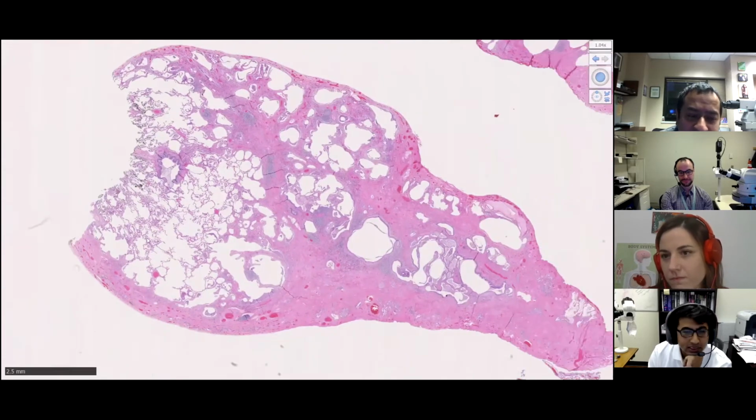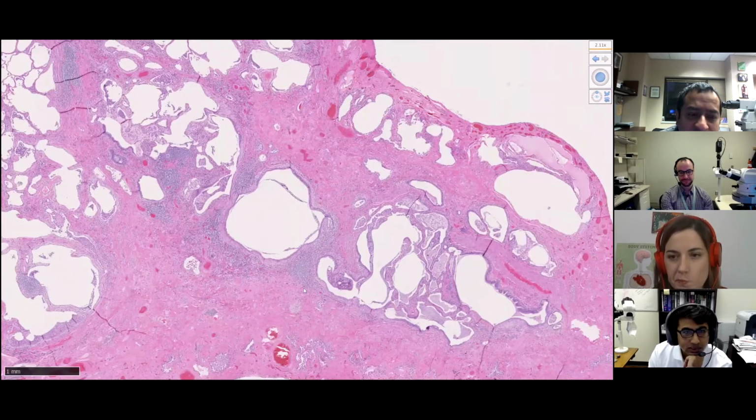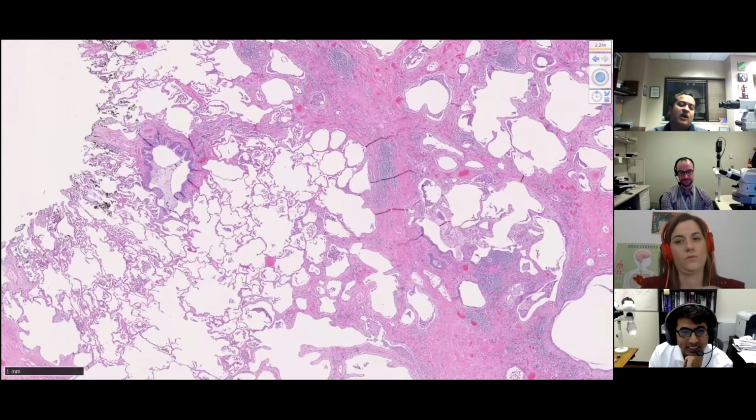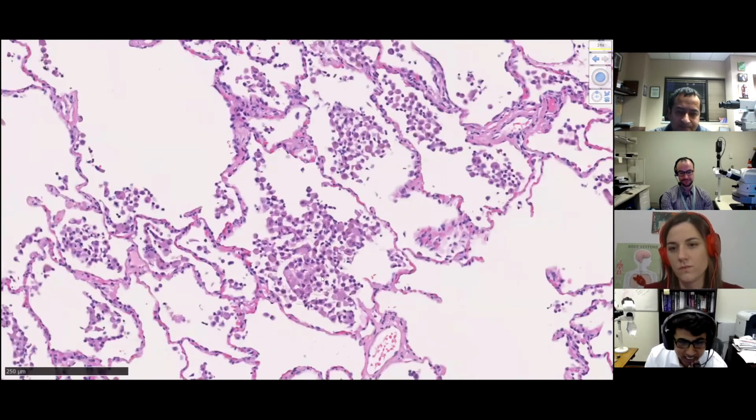And are there smokers' macrophages in there, Raghav, in that lung that you were just showing us? Just show us the alveolated normal lung on the left side. Yeah, there are macrophages. Okay, just checking to see what else is in there. There are macrophages, and yeah, the famous pigmented macrophages are present. Okay.